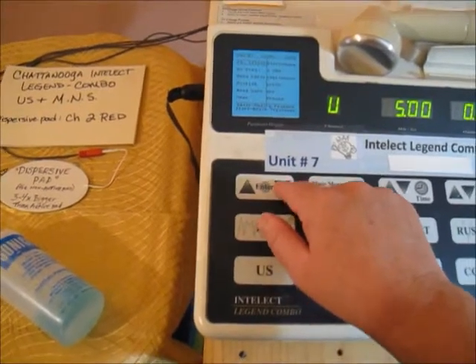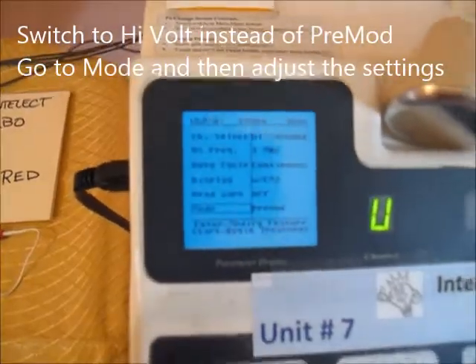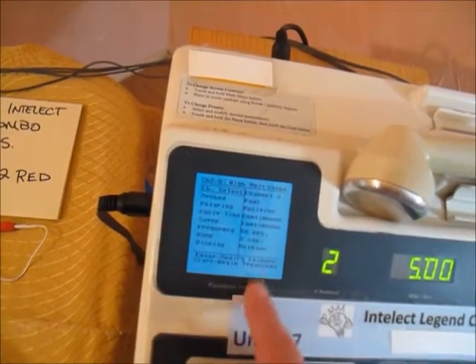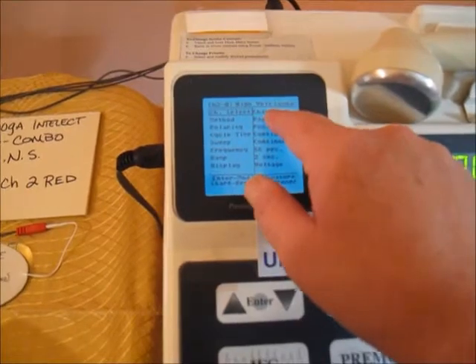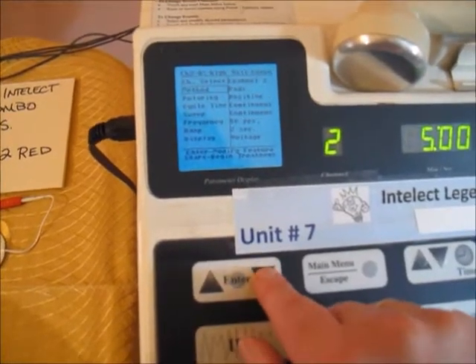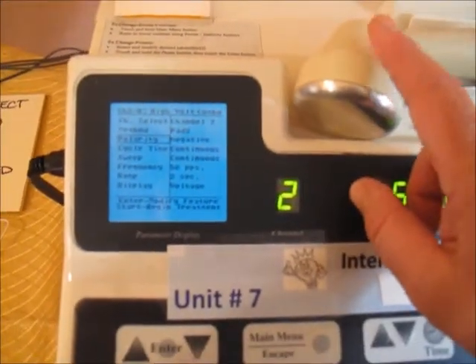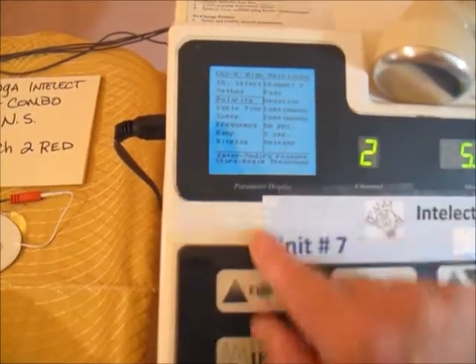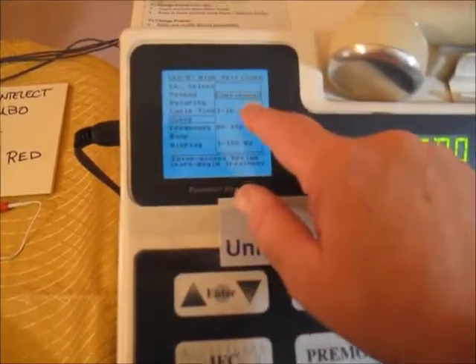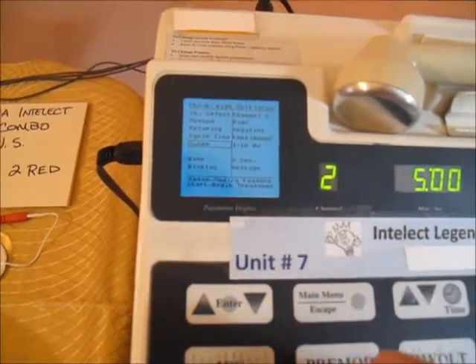If you want to switch from pre-mod, go down to mode, hit enter, select high volt, and hit enter. You'll need to change some settings: the method is pads, but switch the polarity to negative — this gives a better motor nerve contraction out of the ultrasound head. Change your frequency and use a sweep if desired, and set the frequency to your desired physiologic effect.